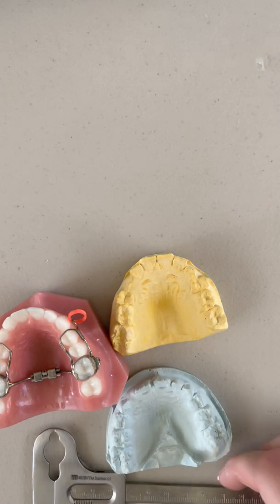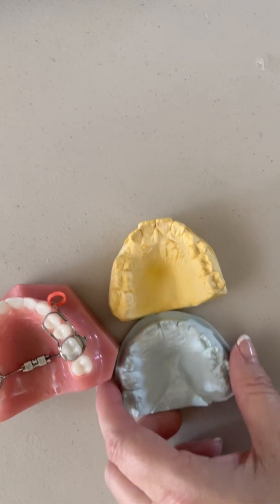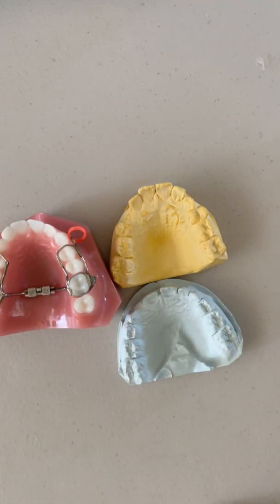Hey, it's Dr. Amanda with Straight Smile Solutions, straightsmilesolutions.com, and today we're going to talk about measuring transverse width in mixed dentition kids to find out if they need expansion or not.